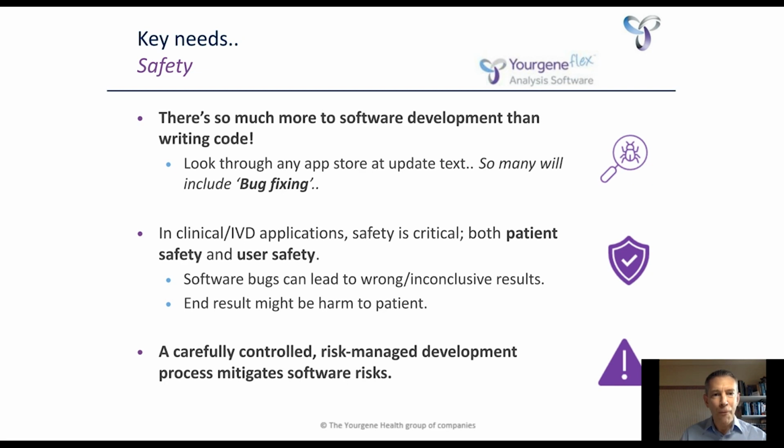So firstly, safety. Now, this means both patient safety and user safety. In the end, when it comes to software, there is so much more to software development than writing code. I mean, all you have to do is look through an app store, look at the update text against a favorite app that you might be downloading an update for, and how many of them are going to say bug fixing.